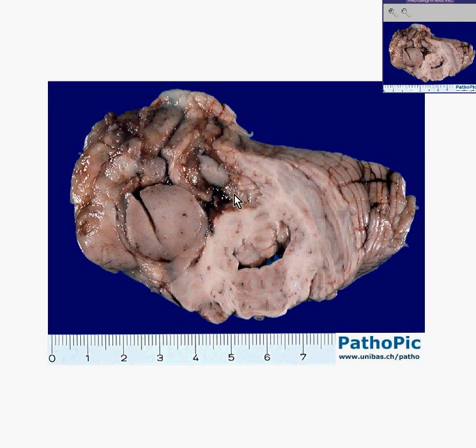This particular type of tumor is actually derived from neural type cells. And the thing that makes this type of tumor so very distinct is that it is almost always found in the midline of the cerebellum of young children. This is a medulloblastoma.